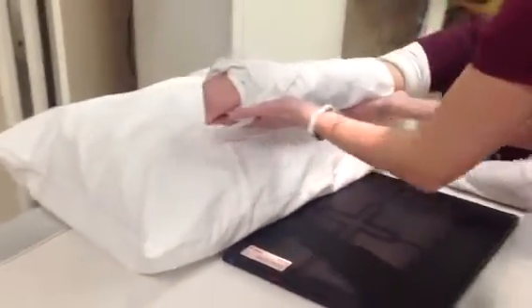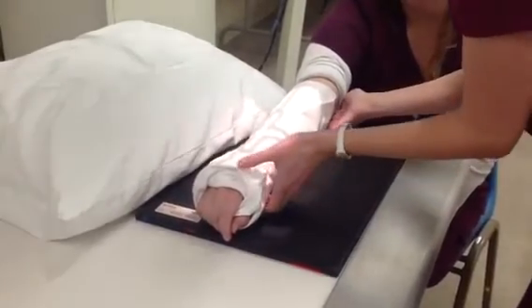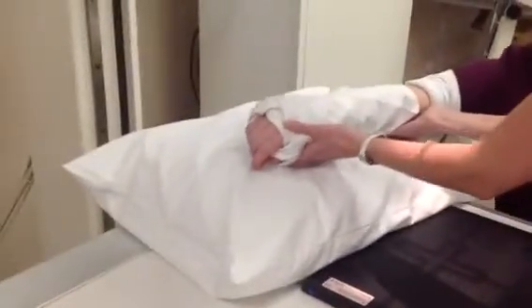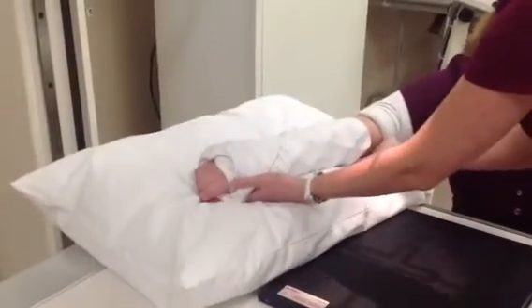When moving a cast, be sure to use open, flattened hands beneath the cast. Offer support at the joints. For extremities, this includes both joints. Always be sure to move a casted extremity as a single unit in one motion.